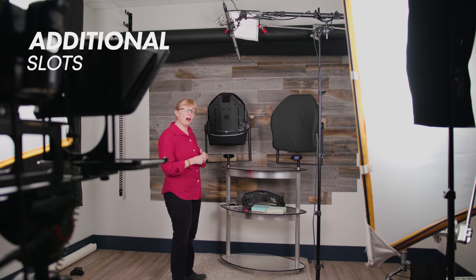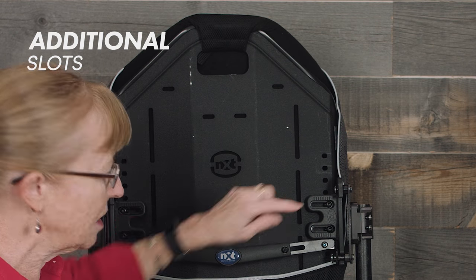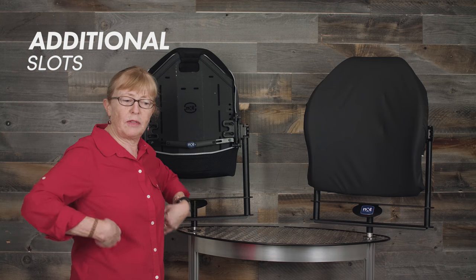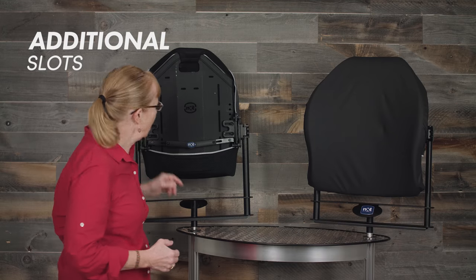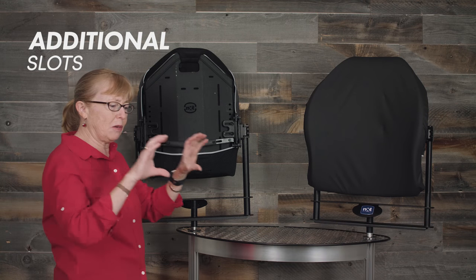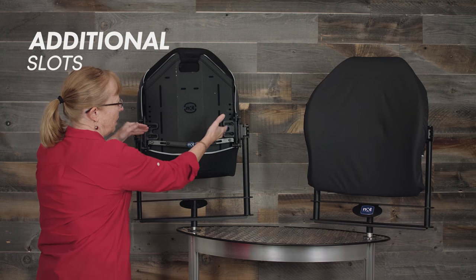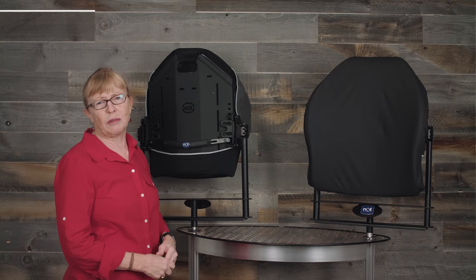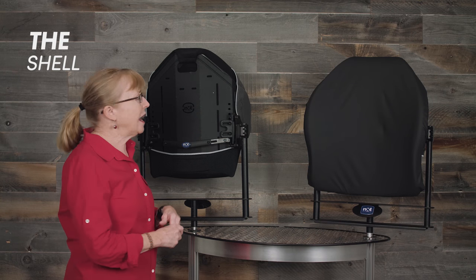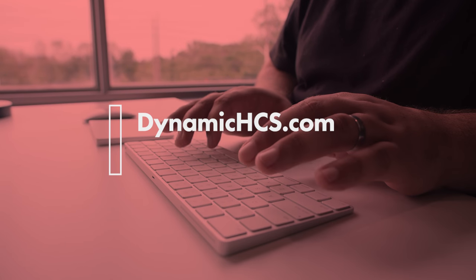On the back of all the back supports we have slots that can accommodate head supports, shoulder supports, and vertical lines for external lateral supports — so if you need to add external lateral supports in addition to the contour lateral, you can do that. There are also extra holes so if mounting hardware lands in the wrong place — for instance, if there's a bolt in the way — you can move where the hardware mounts on the back support. The back supports are made out of a very lightweight aluminum shell with extra ribs built in for strength. For more information, please visit our website at dynamichcs.com.